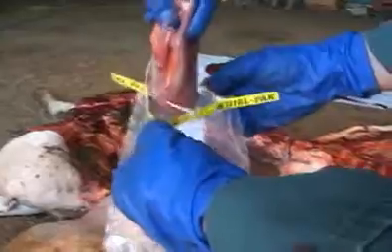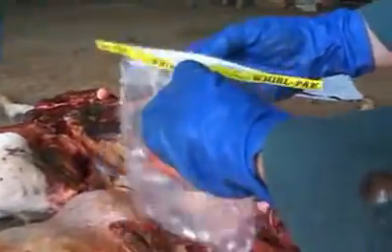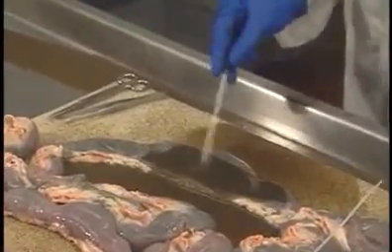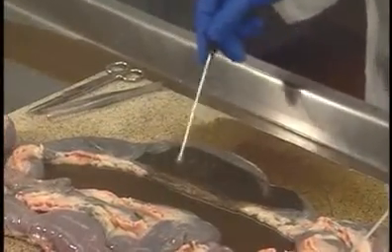There are 2 methods for collecting a microbiology sample. In the first method, a fresh piece of tissue is placed in a plastic bag and submitted to the laboratory where microbiology samples will be taken directly from the sample.